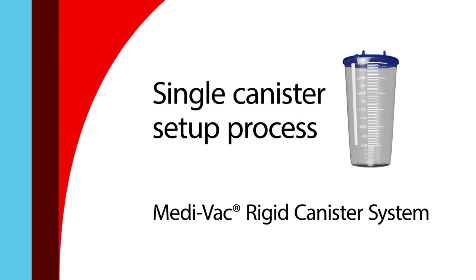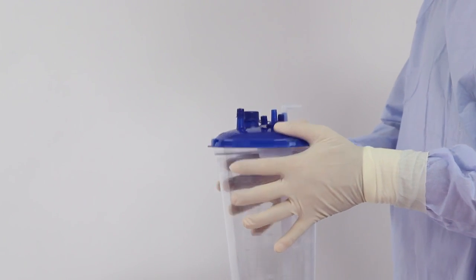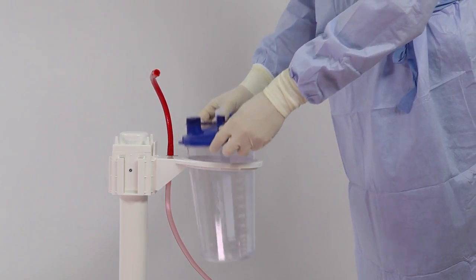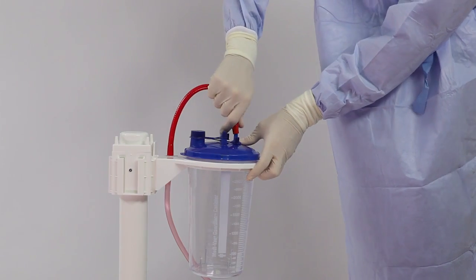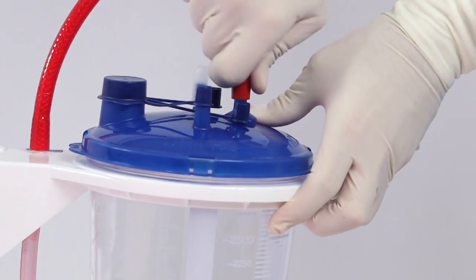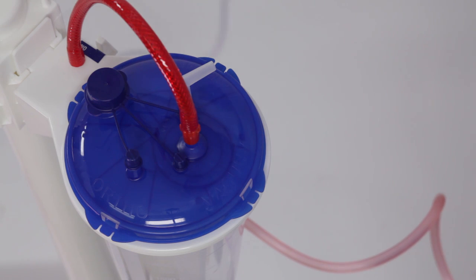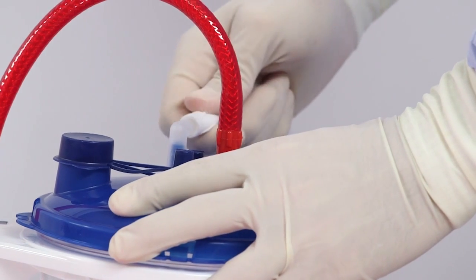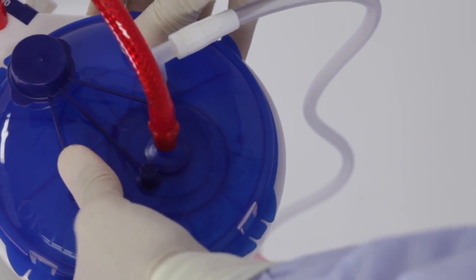To begin the rigid canister setup process, attach the lid to the rigid canister until all tabs have clicked. Insert the canister into the corresponding ring bracket. Connect the red braided tube to the vacuum port using a push and twist motion. Ensure a tight seal. Attach the patient tubing to the patient port.